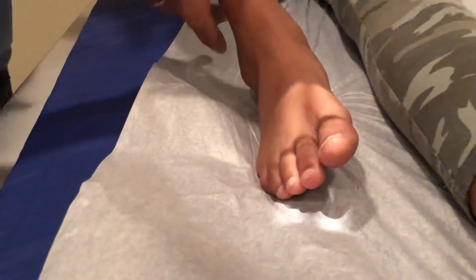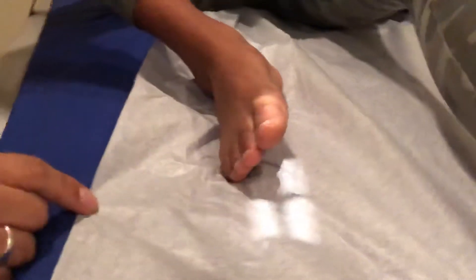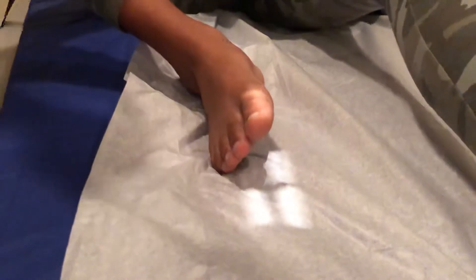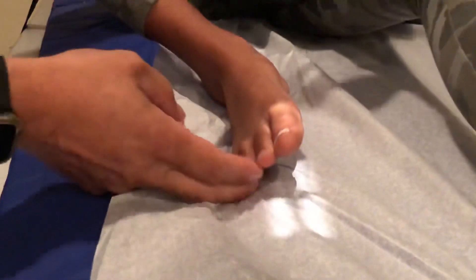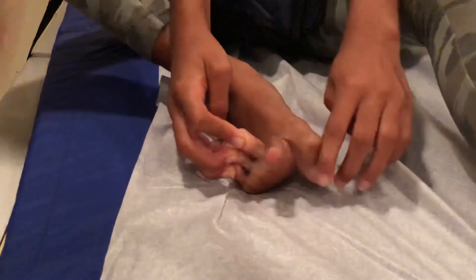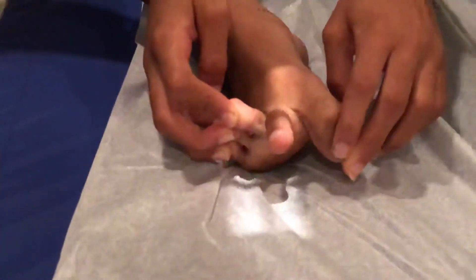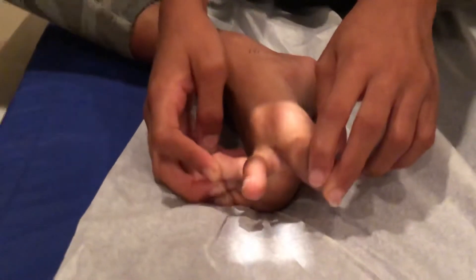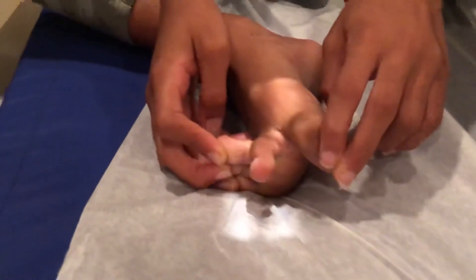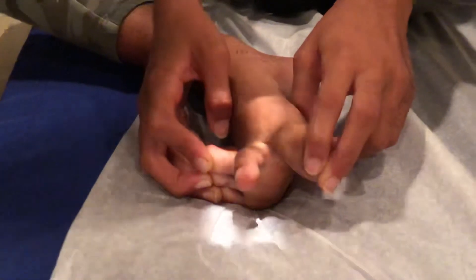The last one is going to be a lateral, so sit up for me. What we're going to do is have the patient pull the third, fourth, and fifth toes one direction and the first toe the other direction. Take this, pull these three back as best you can and take the big one and pull it all the way down. Bring it over here, get the toe in a little more profile, cone down so we don't get the fingers, and shoot the x-ray just like that.